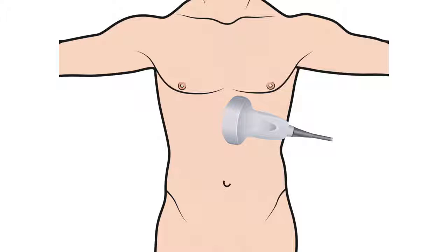Our next view from the subxiphoid is going to rotate the probe to be a sagittal plane, indicator towards the patient's head. And from that midline view, our next view is the IVC view, where we're going to rotate the probe to have a sagittal view. And while imaging at the midline, we're going to tilt the probe slightly to the patient's right to image the IVC, which is just to the right of midline.